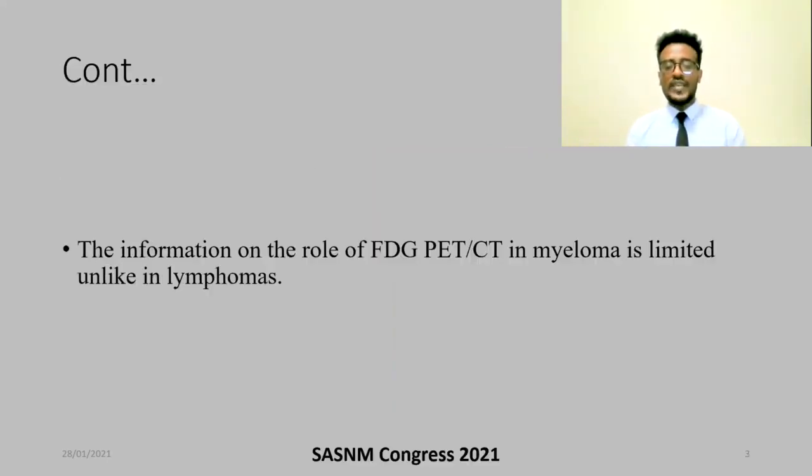So why are we interested in this topic? Our main reason was due to the absence of standardized PET-CT interpretation criteria in myelomas. There is limited uniform information regarding the role of FDG PET-CT in myeloma and particularly its relationship with bone marrow biopsy in assessing marrow involvement.